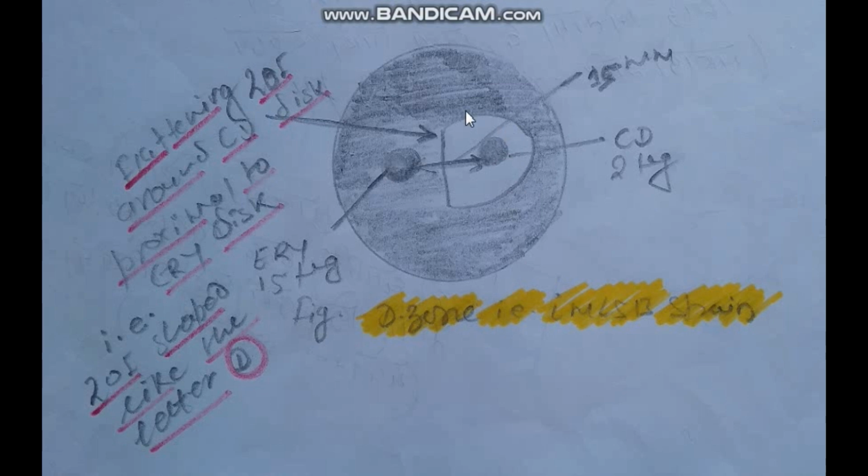A flattening of the zone of inhibition around the clindamycin disc proximal to the erythromycin disc, producing a zone of inhibition shaped like the letter D, is considered a positive result.